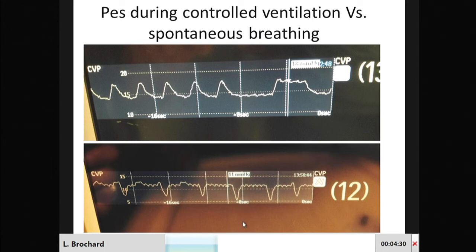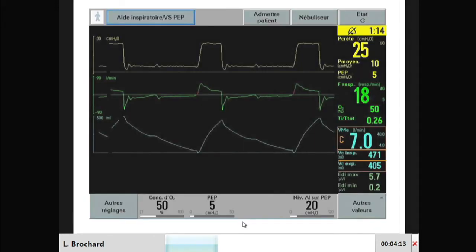When you want to measure the muscular pressure, ideally you should calculate the difference between the two. This is a very beautiful technique, a reference technique, but I agree it is complicated. And monitoring the diaphragm EMG may be an easier technique to do that.